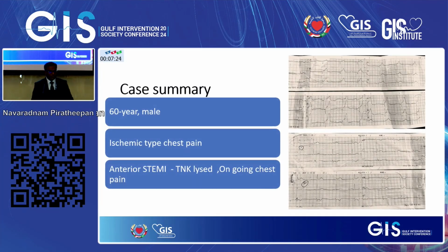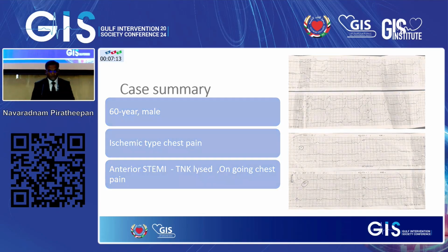This is a 60-year-old male with anterior STEMI. Thrombolysis was done. Then around the middle of the night, we got a call that the patient had ongoing chest pain, so we brought the patient to the cath lab.